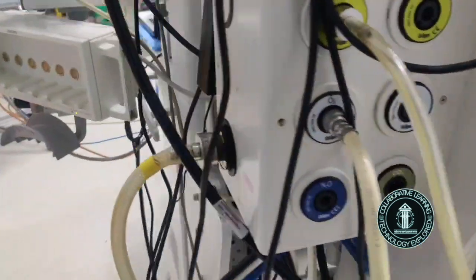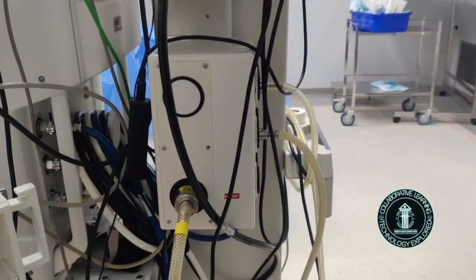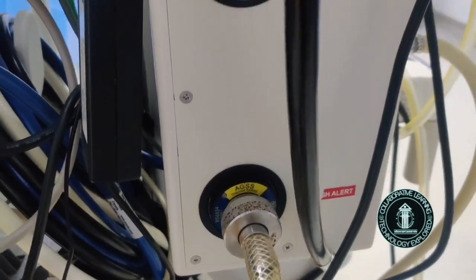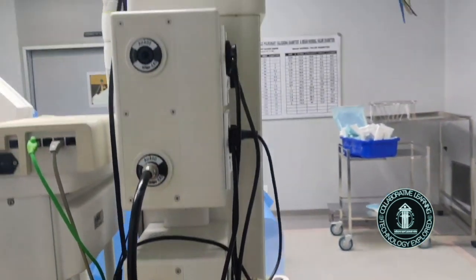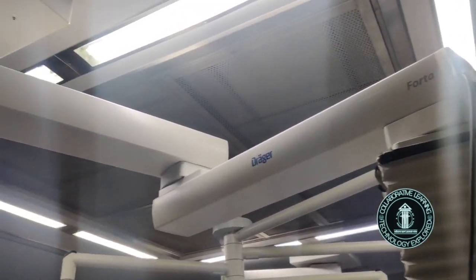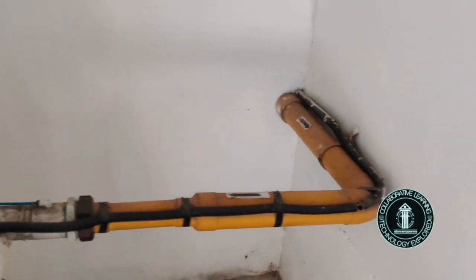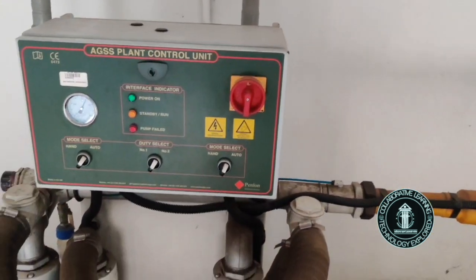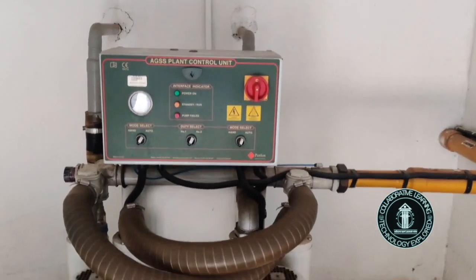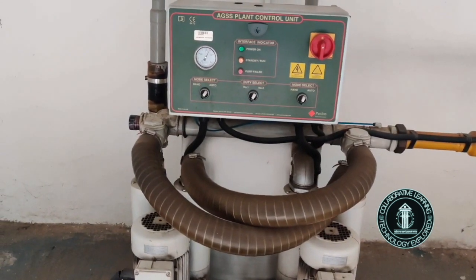And as all of you know, an anesthesia pendant is a setup where the anesthesia workstation, the working area, the power sources, other gas sources, and the data communication interface are all in a single arm. From there, inside this pendant, the gas is ducted outside through the rooftop to the disposal system. So this is the terminal-most unit of a disposal system. That's the AGSS plant control unit, which is kept on the terrace. This particular type of disposal system or terminal unit is called a blower or low vacuum type. There are many different components for this plant.